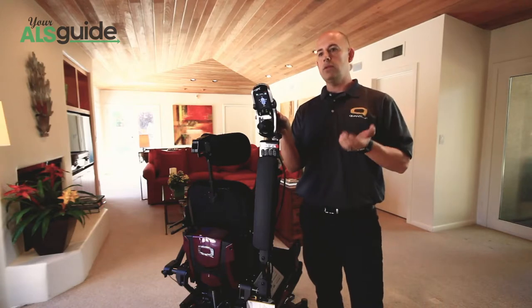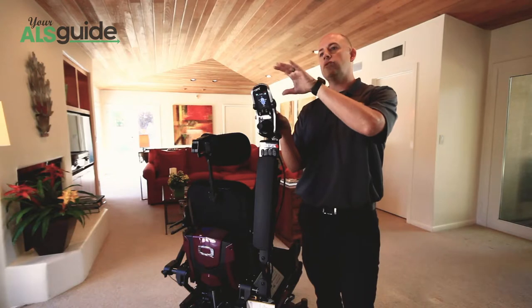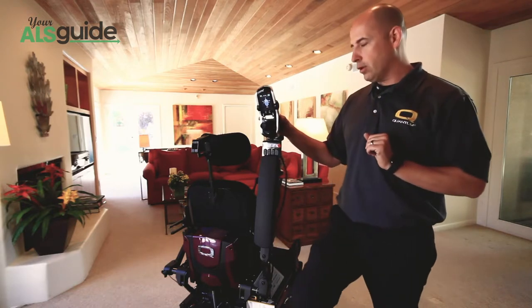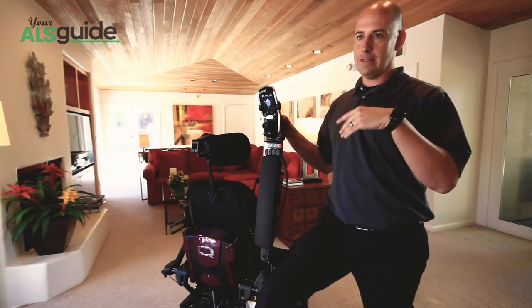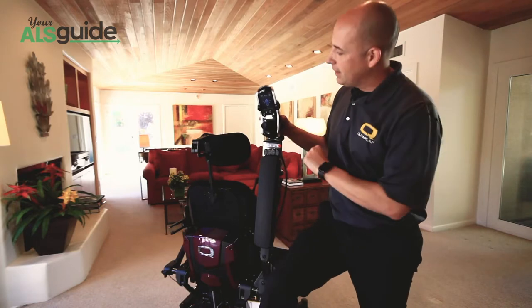So when you go into your device, you'll turn on your Bluetooth. You're going to search. It's going to say chair 9250 or something along those lines, whatever your chair ID is. Then you'll pair it, very similar to pairing any other Bluetooth devices with your phones. It's going to ask for a code. You're going to say yes in both screens. And then voila, you are paired.